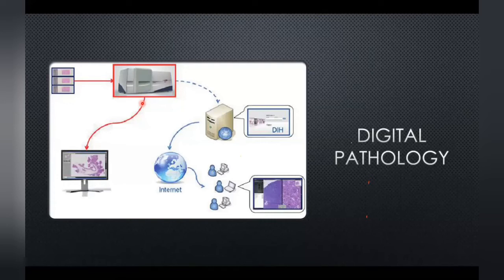They click the images, and the moment they're clicked and the next one is clicked, it is joined together. That's called stitching. So you have clicking and stitching, clicking and stitching. It forms a large image which runs into GBs of data. That image size can be anywhere from 2 GB, 5 GB, or maybe more, because it has so many pixels in it.